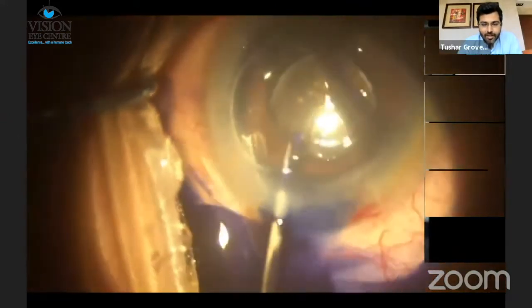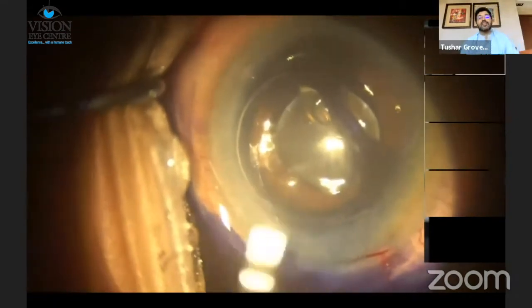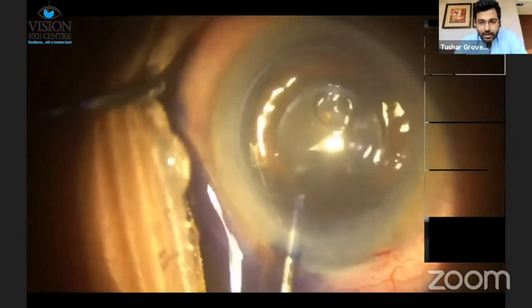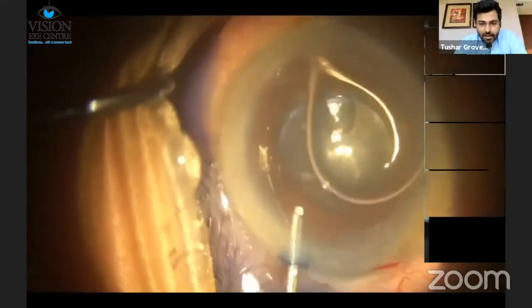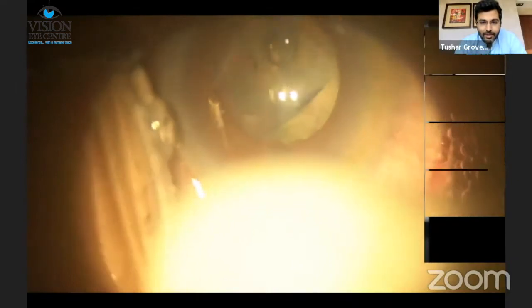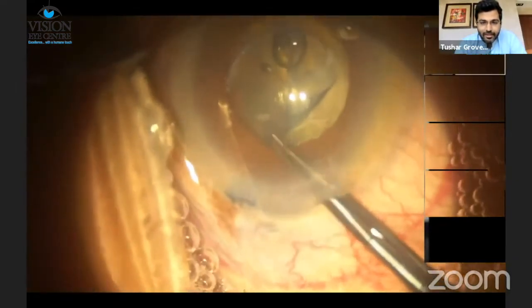When you look at this case, it's quite evident that a part of the capsulotomy by the femtosecond laser has been done over the iris — the energy has been delivered onto the iris — and quite evidently there is an area of uncut capsulotomy. In these situations this can be quite tricky because you have that uncut area, and it's possible that this can extend peripherally.